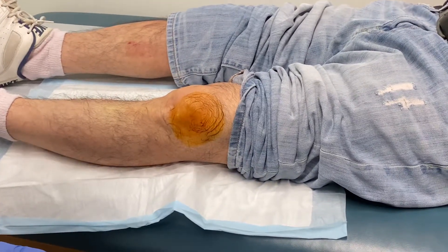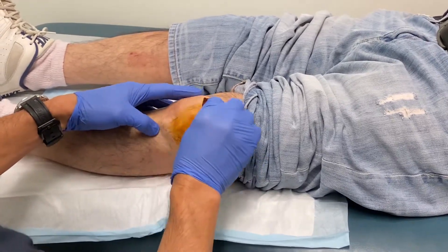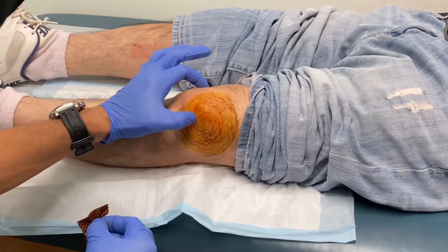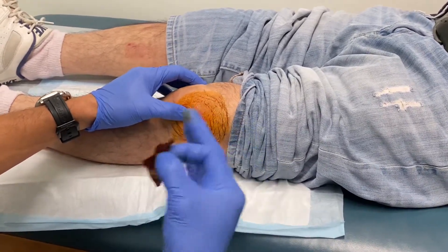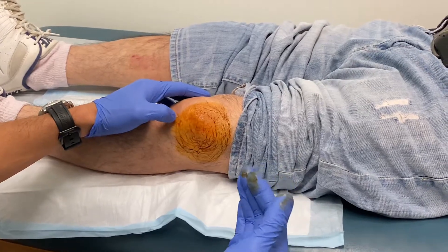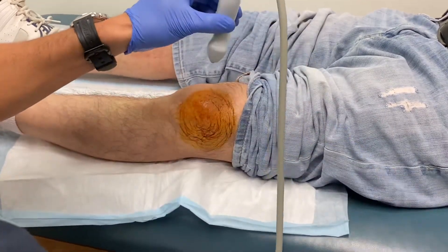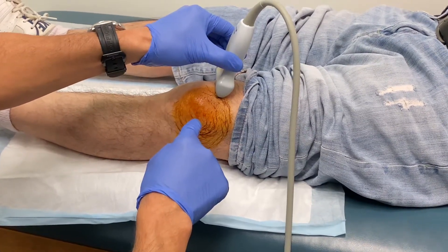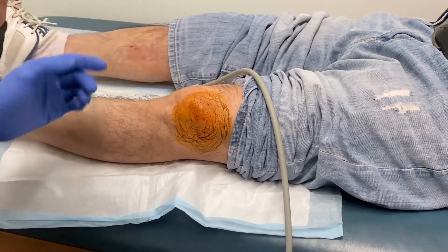Dr. Maher here doing a platelet-rich plasma injection. This is a gentleman that has osteoarthritis of the knee. He's already had some treatment in the past. I'm choosing to do it with the patient lying down — that way the patient's comfortable, and if they get lightheaded they're not going to faint. We call it a supine position. The other reason to do it lying down is it allows me to use my ultrasound, and in this position I'm able to go into the joint much more reliably than with the traditional sitting technique.